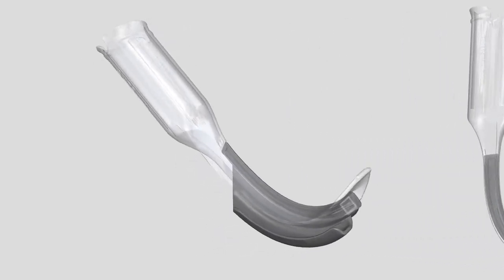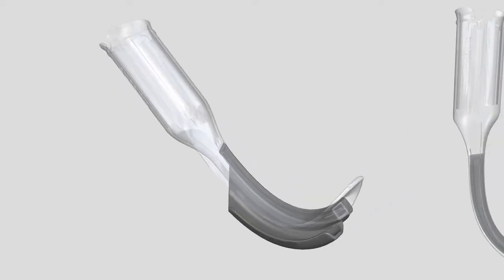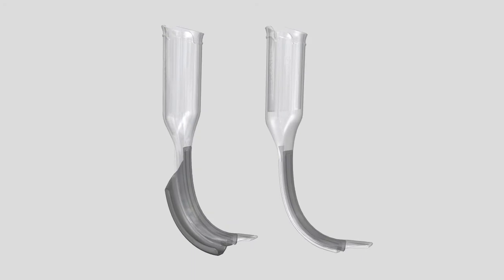The channeled blade incorporates a guiding channel to facilitate delivery of an endotracheal tube, or ETT, to the patient's vocal cords. Channeled blades accommodate a specific range of ETT sizes and do not require the use of a stylet. Non-channeled or standard blades contain no guiding channel and will likely require the use of a stylet to assist in delivering the ETT to the vocal cords.